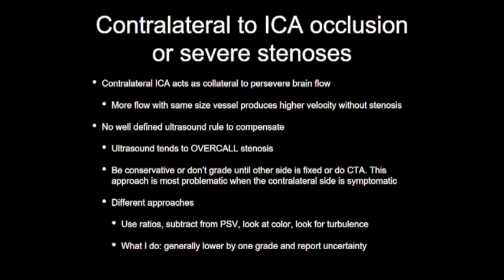And so what are the ultrasound rules? Well, I will tell you that I've been following the ultrasound literature on this forever, waiting for an answer, and there is no answer so far. There are people who say you subtract 20 centimeters per second from the number. Some people say you subtract 30. Some people say you abandon it completely. You just say there's something there. Other people say use a ratio. I don't want to say who may do what.